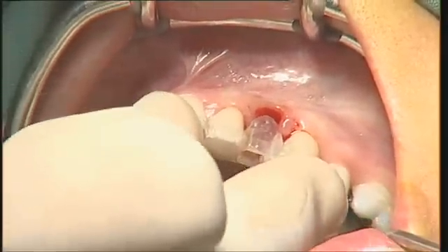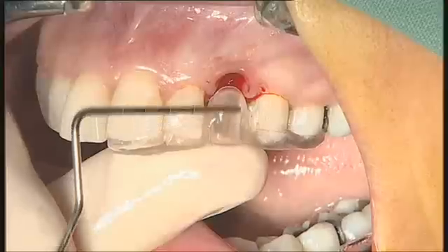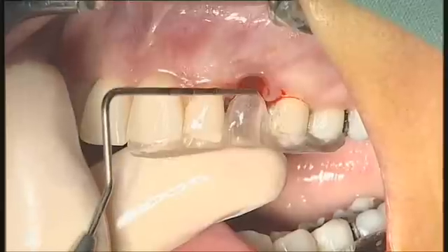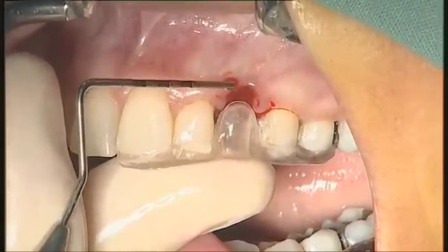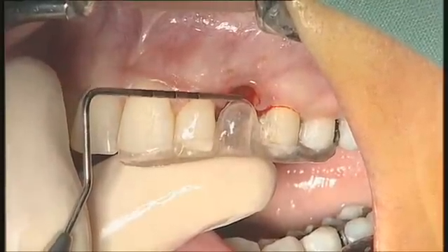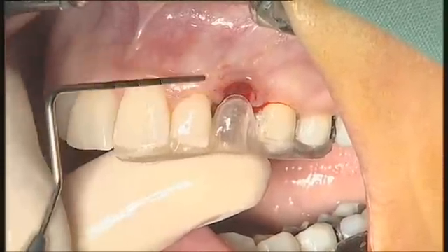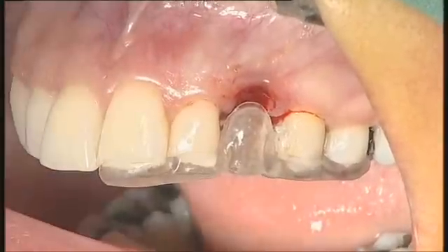What is important is that this surgical guide has been prepared with an ideal position of the final collar of the tooth. My reference point will not be the current soft tissue, but rather a slightly more coronal position, which will be my reference for implant placement. This means I will later add some connective tissue there just to cover the collar.